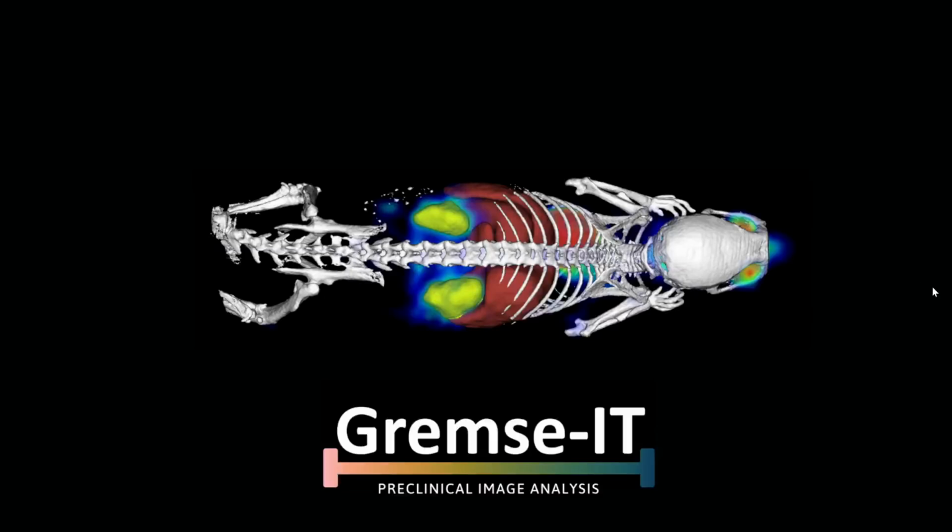Hello, welcome to this tutorial video where I would like to show you some different ways to segment a mouse heart using the Imalytics Preclinical software.